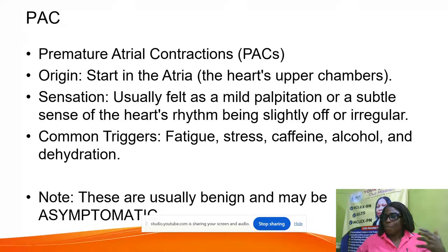So most times you see it when the patient is doing some other routine test. And like I said, I'm going to distinguish for us so that we know when to freak about it, and when there's no need to freak about it. Are we good? So that's PAC.